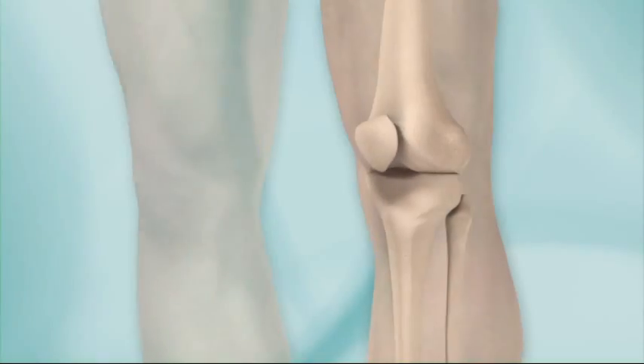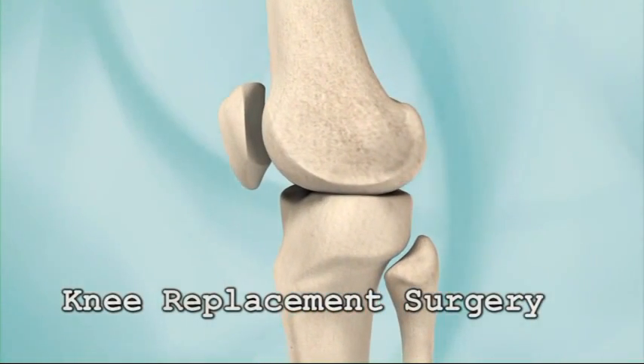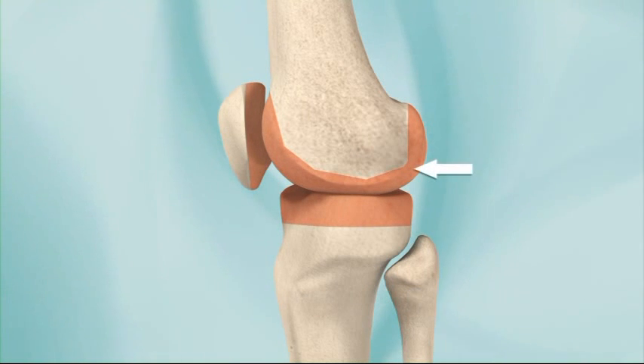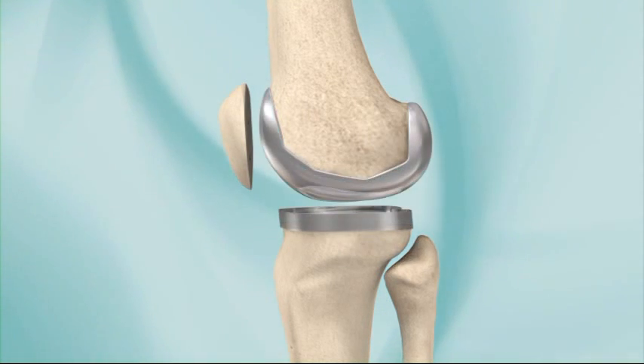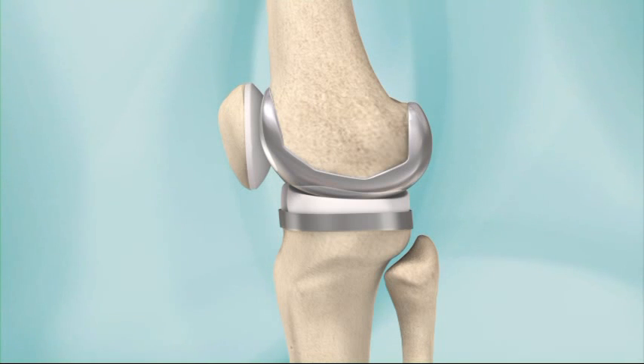In a total knee replacement, the entire knee is not actually replaced. Typically, no more than a thin layer of bone is removed from three places: the end of the bone above the knee, the end of the bone below the knee, and the back of the kneecap. A metal cap and tray are attached to the ends of the leg bones with a plastic liner between them. A plastic part is attached to the back of the kneecap.